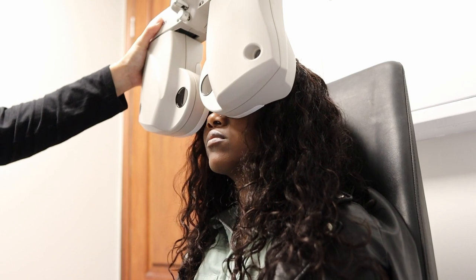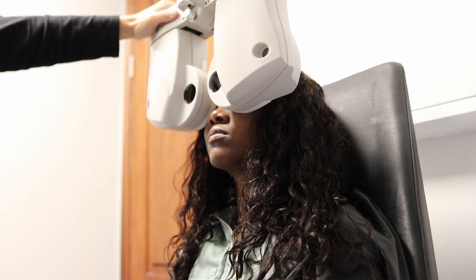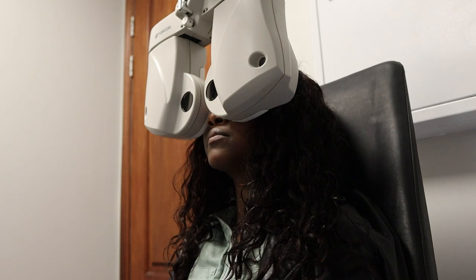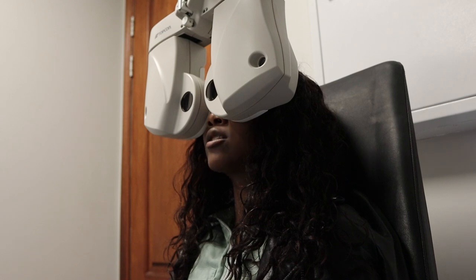Just a little bit to your right with your head. Come on. Okay, can you see the F? Yes. Read then. Okay, G-F-C. Yeah. O-N-H-E-R-P-T-V-S-D. N-H-L-K-O. V-Z-E-R-P. B-A-C-D-S. E-R-S-O-V.